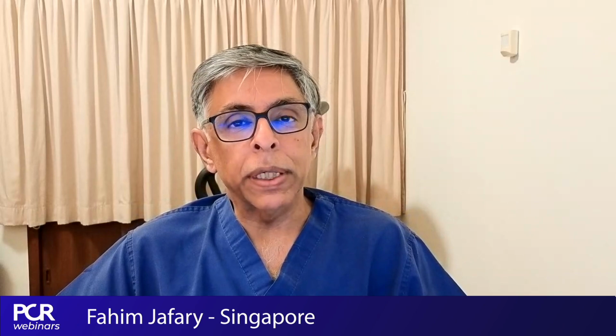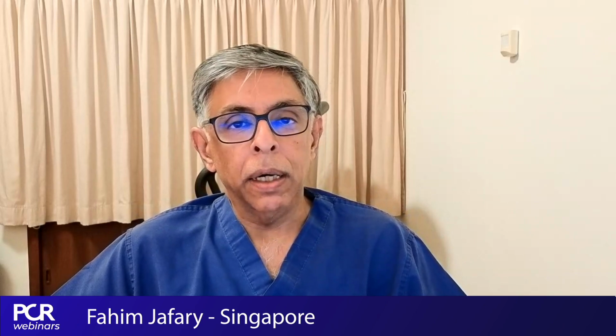Yes, Goran. We don't routinely image if the vessel is open and it looks good angiographically. I think that's good enough. In this particular case, we just imaged because we were curious to see what that haziness was, and you can see that there was a little bit of calcium up there that had developed in the subsequent years. But I think routine imaging, if it looks okay, looks patent, post DCB, we don't tend to do it.